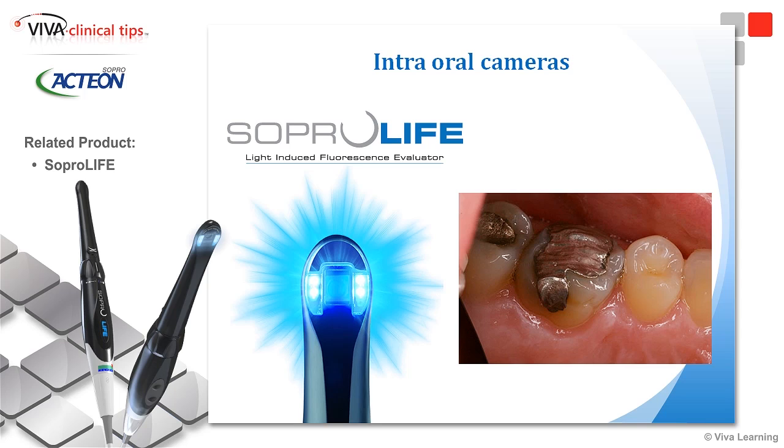And it's real important from a patient education standpoint, along with if you're diagnosing, let's say, this first molar in the photograph for a crown, send it off with any documentation that you need. Very easy for somebody to go, yeah, the tooth needs a crown. Whether it shows up that way on a radiograph is a whole other deal, but that picture tells the story.